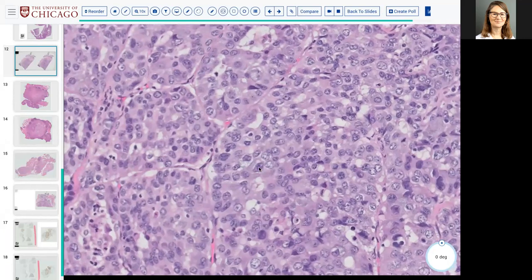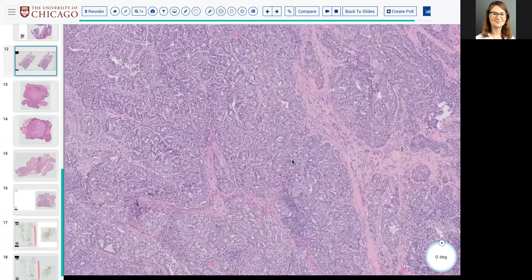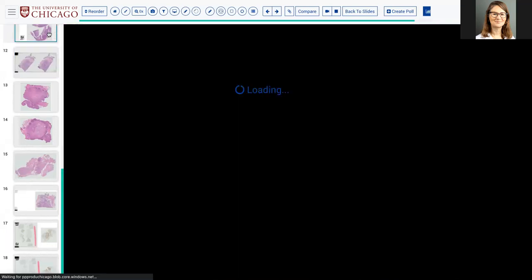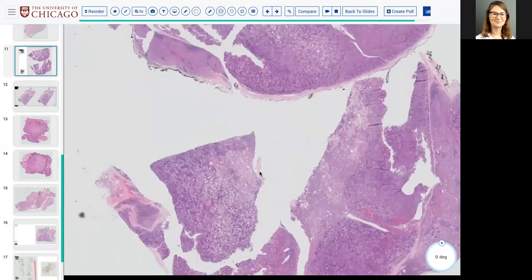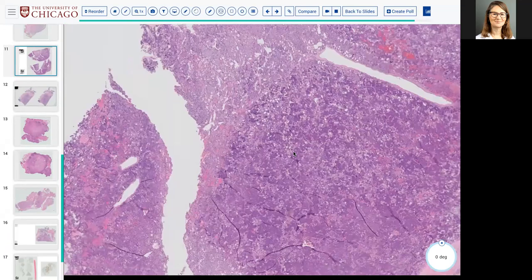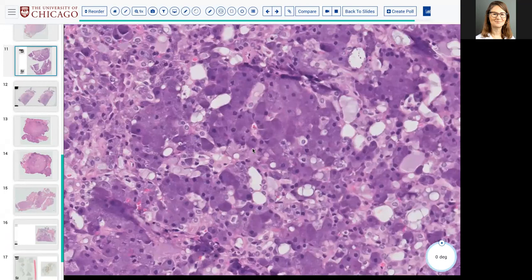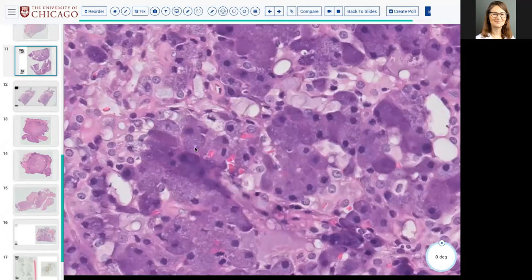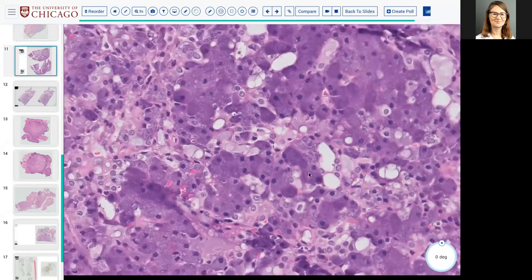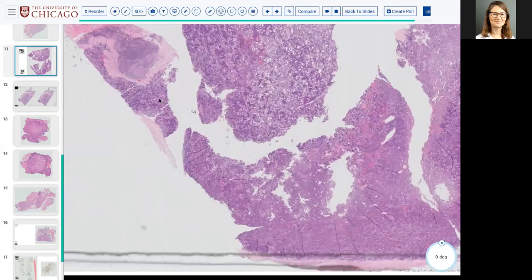You look over here and say, I can't tell where that came from. That's the theme of these last slides: if you look hard, you can find where it comes from. I've given you an example of a nice lower grade, circumscribed acinic cell carcinoma that has these nice purple zymogen granules. What's the one stain we use to highlight those zymogen granules?